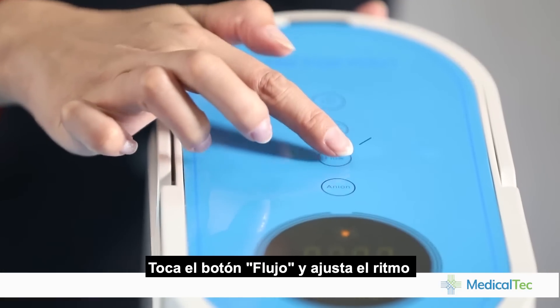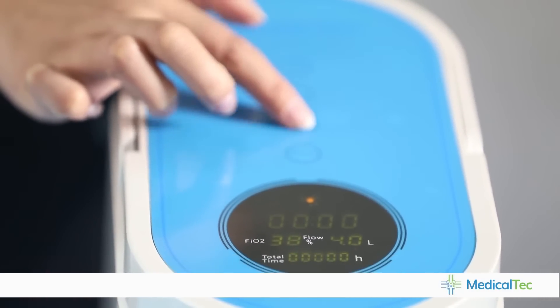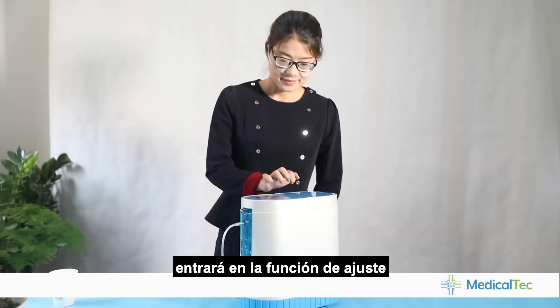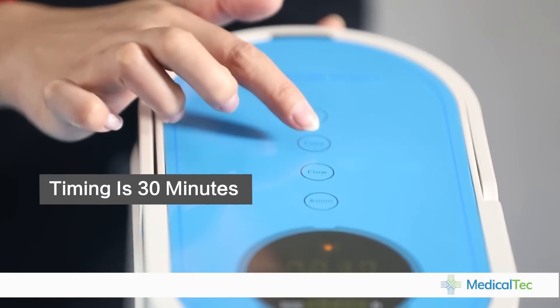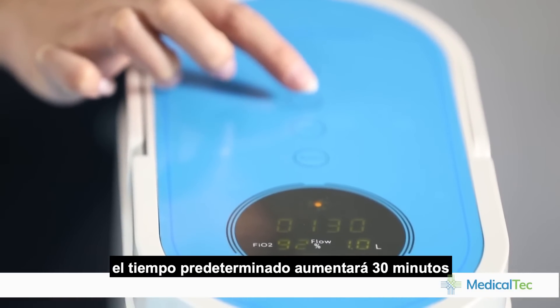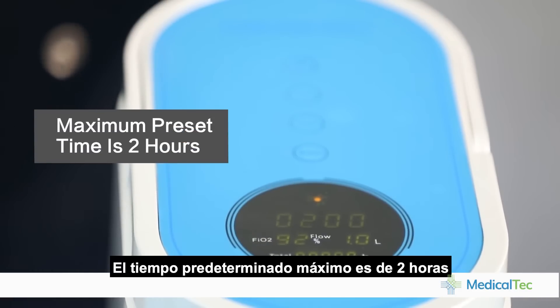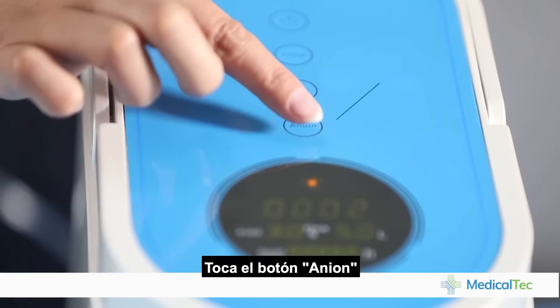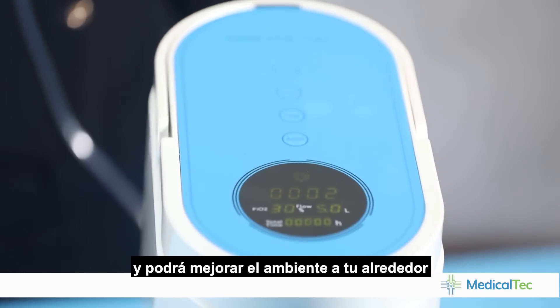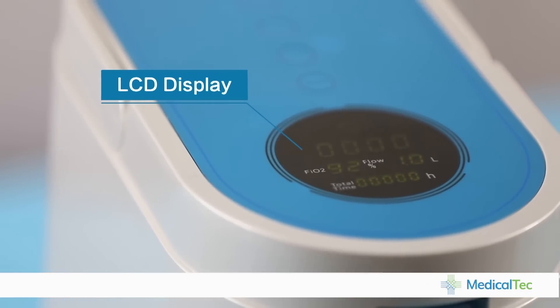Touch the flow button to set the flow rate, which can be set from 1 liter to 5 liters. Touch the time button to enter the timing setting — the default is 30 minutes. For each press of the time button, the preset time increases by 30 minutes, with a maximum preset time of 2 hours. Touch the anion button to activate the anion function, which can improve the environment around you. All detailed information will be shown on the LCD display.